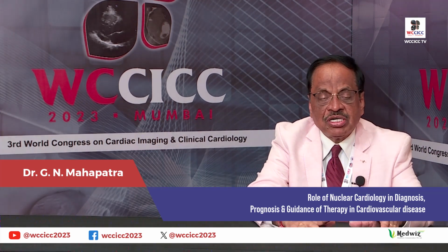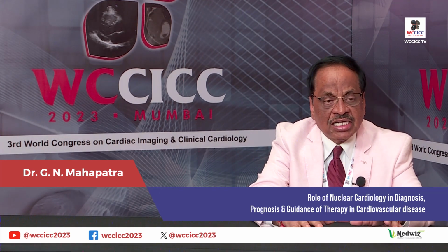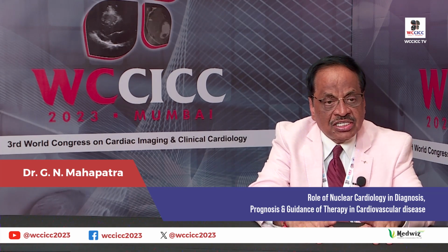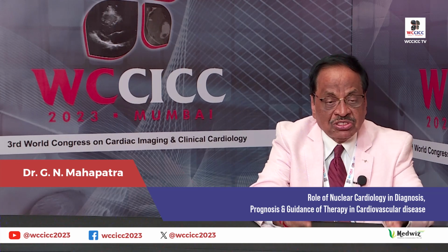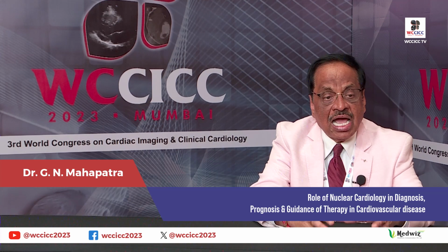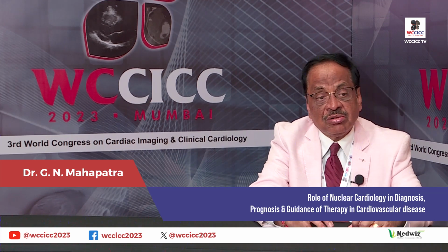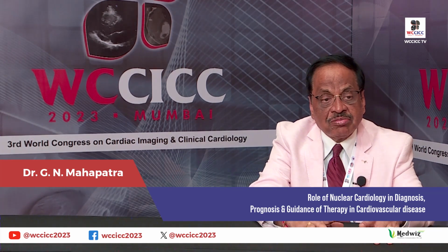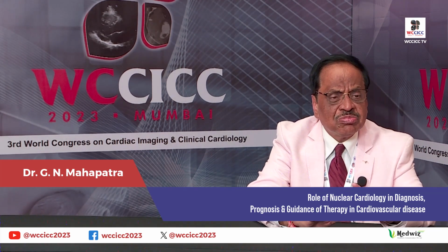So nuclear cardiology has a very big role in the diagnosis of coronary disease, in the treatment planning which I discussed, in the detection of atheromatous plaque, and also in the detection of the infection process and monitoring it after treatment. So it has a huge role.